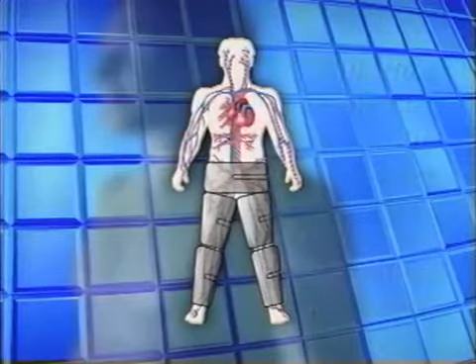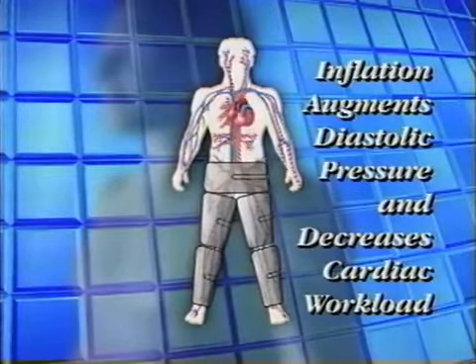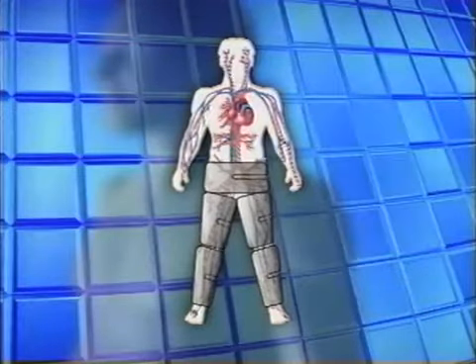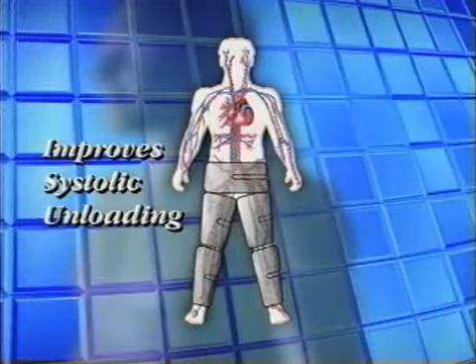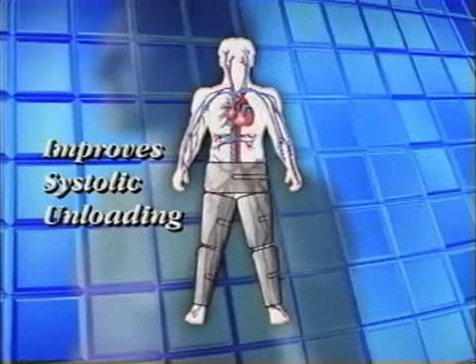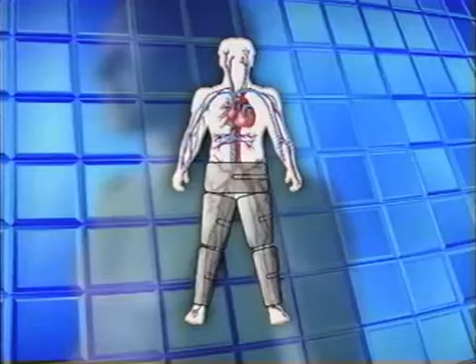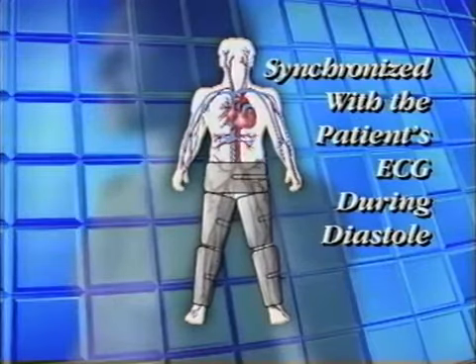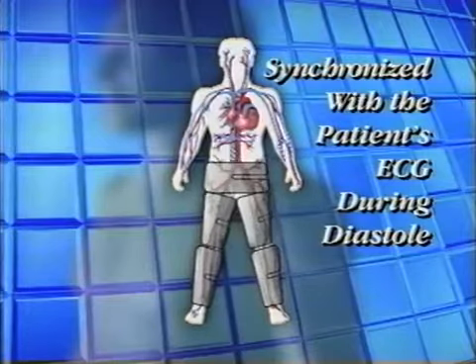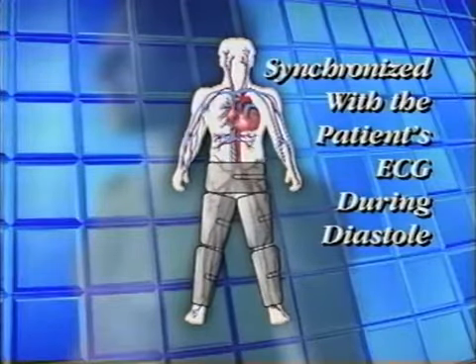Working together, the system cuffs ultimately augment diastolic pressure and reduce cardiac workload. And because the cuffs are deflated before the onset of systole, systolic unloading is improved as there is less resistance to pumping blood out of the heart. Inflation of the cuffs is synchronized with the patient's electrocardiogram, or ECG, and is timed to occur only during diastole, when the heart is momentarily at rest.